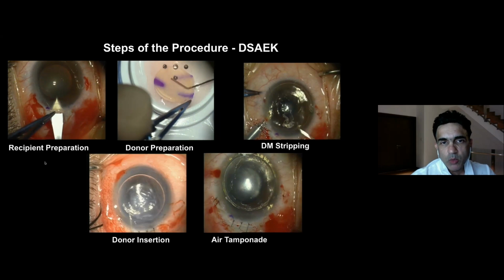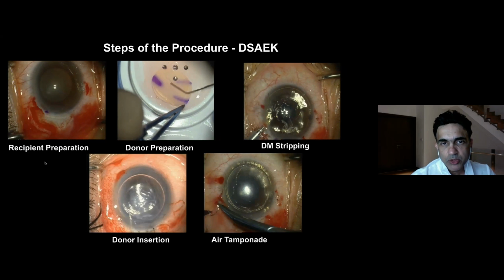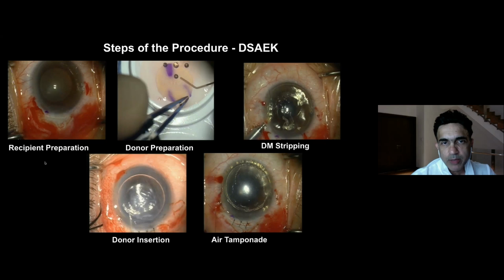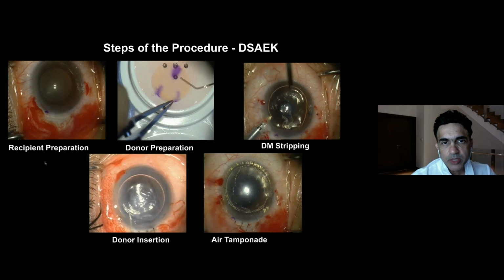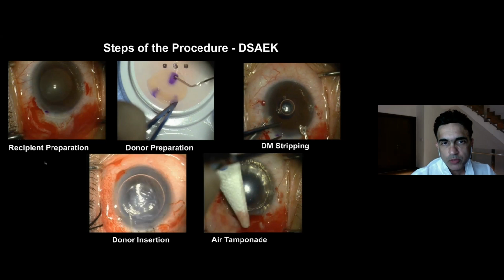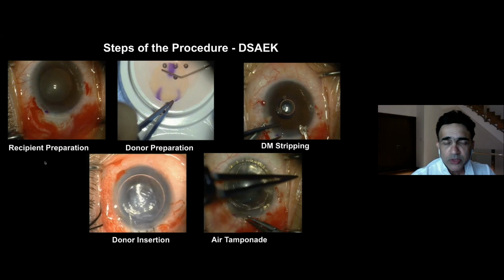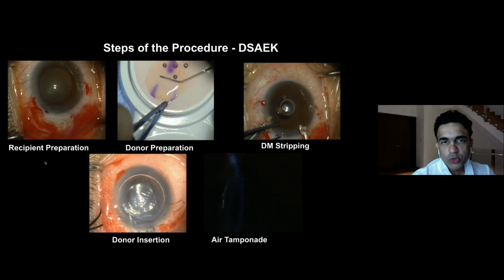What the ALTK system will do is cut the anterior cap of the donor. Here you can see I'm releasing the anterior cap from the posterior lamella, and of course that's where the important endothelial cells are lying. Ideally you're trying to cut as thin a tissue as possible. Most times now we're trying to cut in the range of less than 100 microns because we know this will affect the visual acuity afterwards. The thinner seems to be better, but you do have to bear in mind that it does require more manipulation inside the anterior chamber when you're doing the surgery itself.